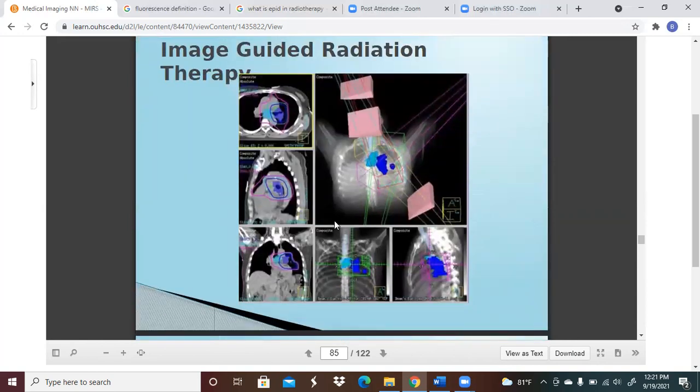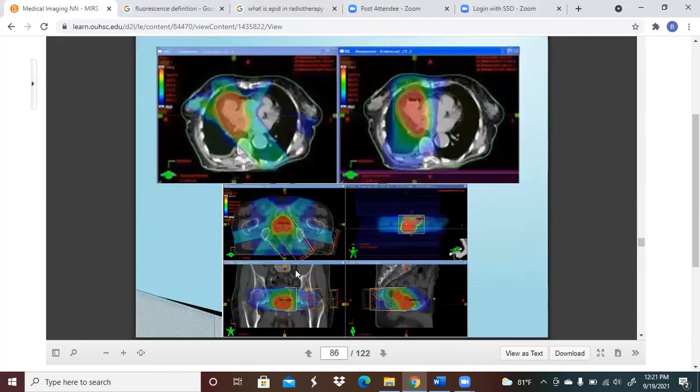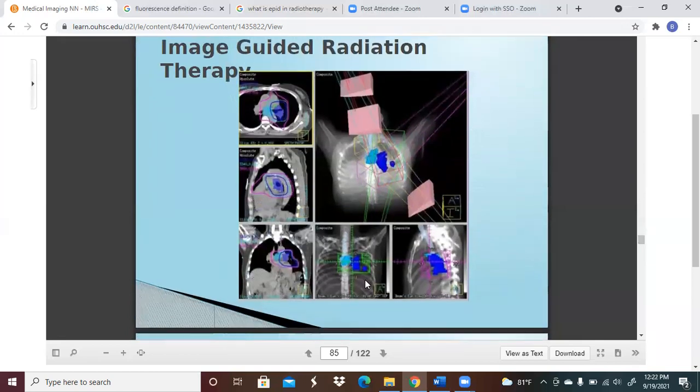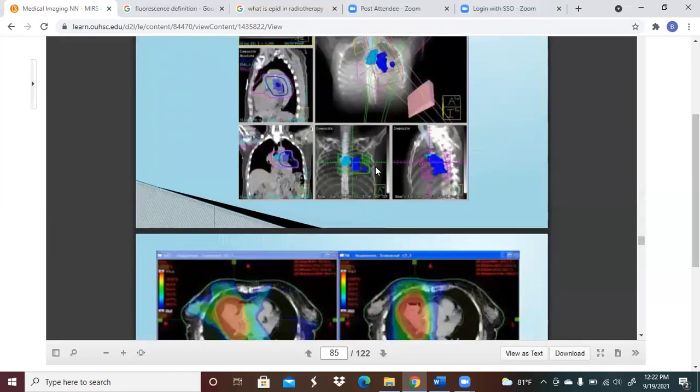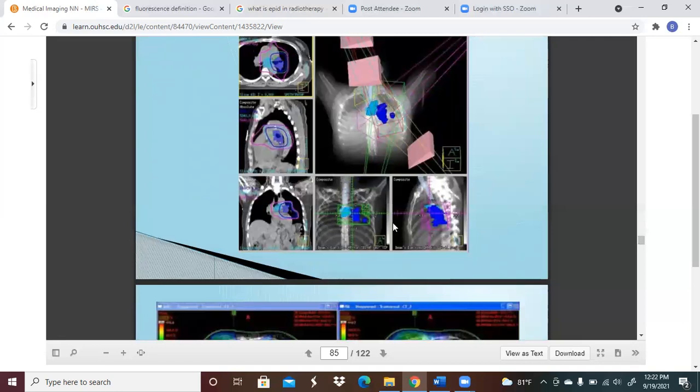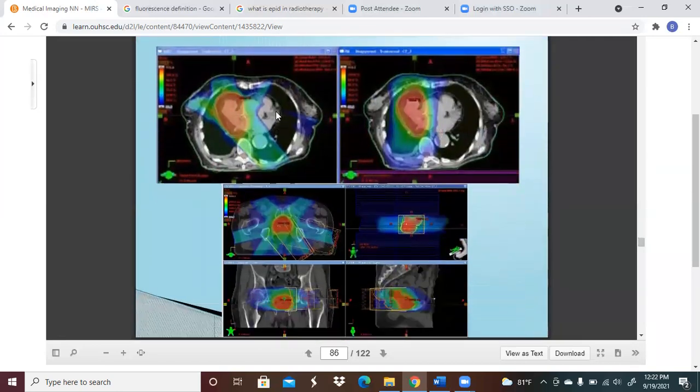And that's the same kind of thing going on here. This, I believe, is Exio. That's the planning system here. Or could be, well, no, I believe that is a Pinnacle. Sorry, my bad. I believe that's Pinnacle. I recognize the block shape here. This is Eclipse.